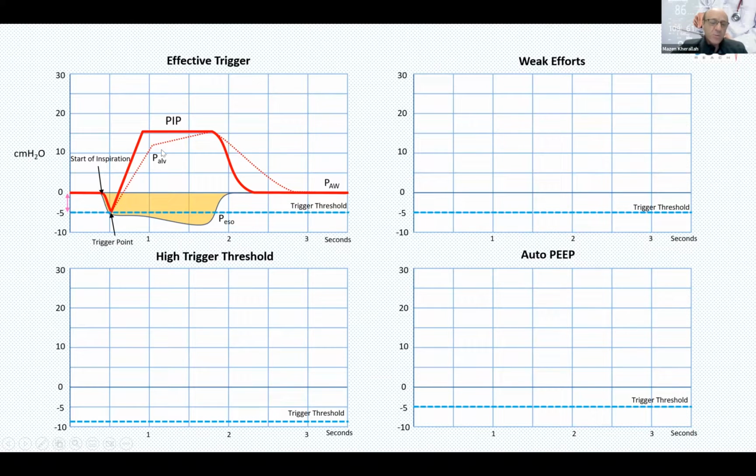When you're looking at the alveolar pressure, you need to remove the pressure required to overcome the resistance. And once the ventilator finishes the breath, the airway pressure drops suddenly. However, the alveolar pressure will drop gradually till we empty the lungs completely.